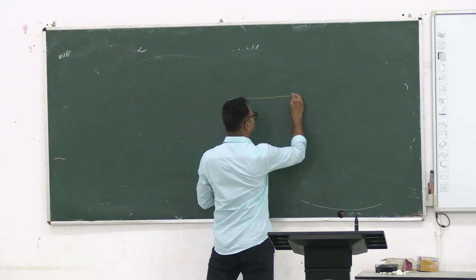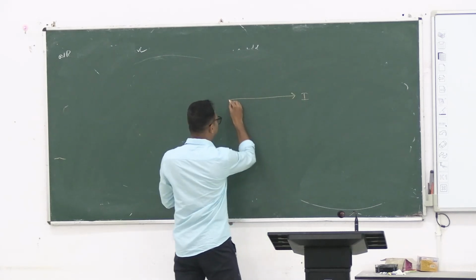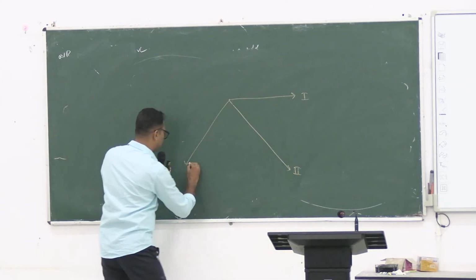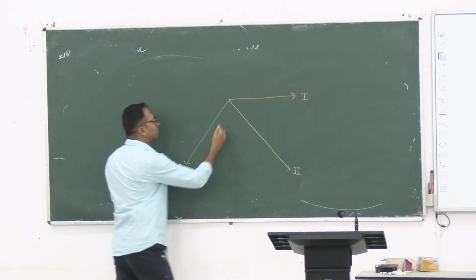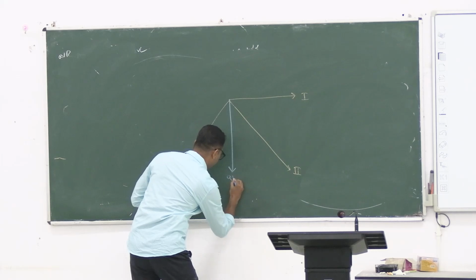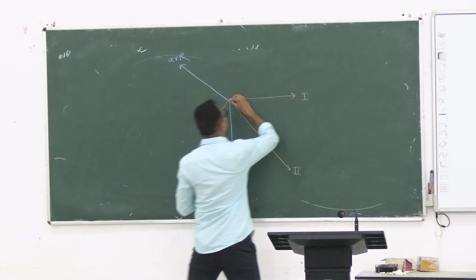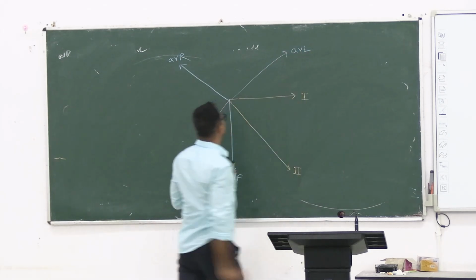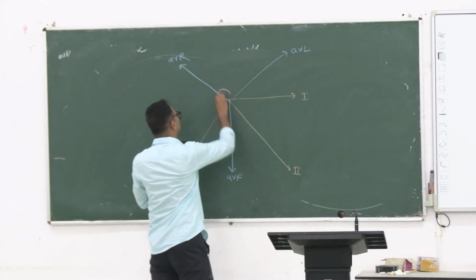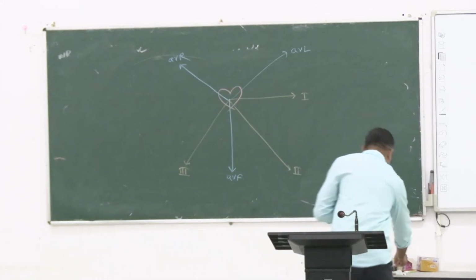Lead 1, lead 2, lead 3, good. Clear. And here lies your favorite thing, the heart. Correct?